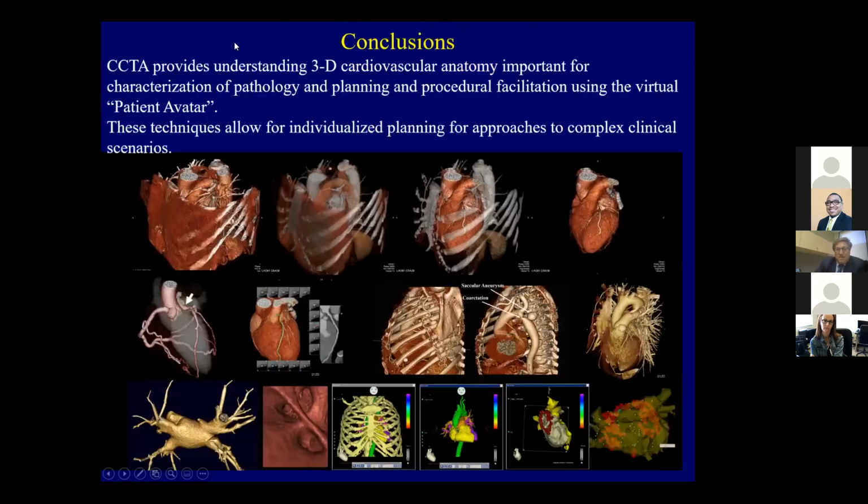So we've covered a lot of material. I think it's important just to recognize the power of the coronary calcium score in terms of risk stratification.